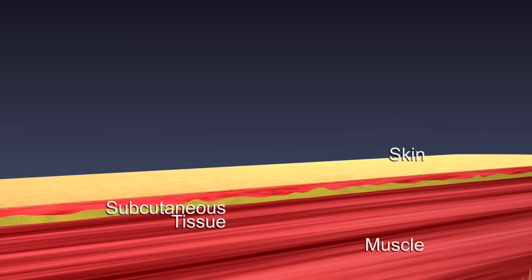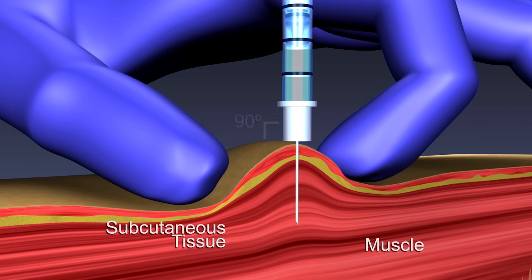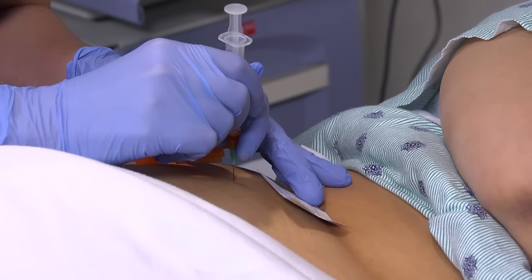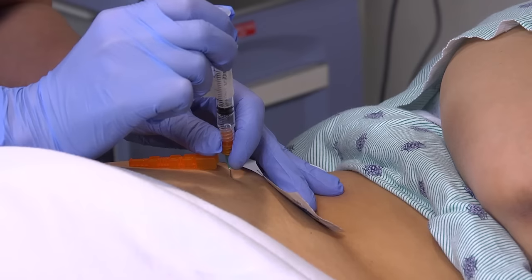If the patient has little muscle mass, grasp the body of the muscle between your thumb and forefinger. With your dominant hand, quickly pierce the muscle at a 90 degree angle to the skin. Continuing to pull the skin taut with your non-dominant hand, stabilize the syringe by grasping the lower end of the barrel with the fingers of the non-dominant hand as they are resting on the patient. Attempt to aspirate by pulling back on the plunger with your dominant hand. If blood appears, you're not in the muscle. Remove and discard the needle and syringe and start over.